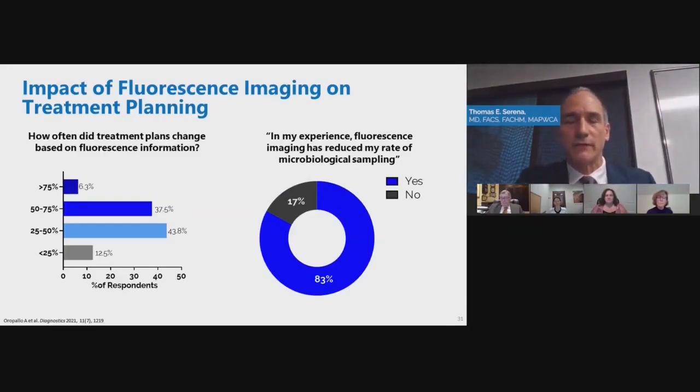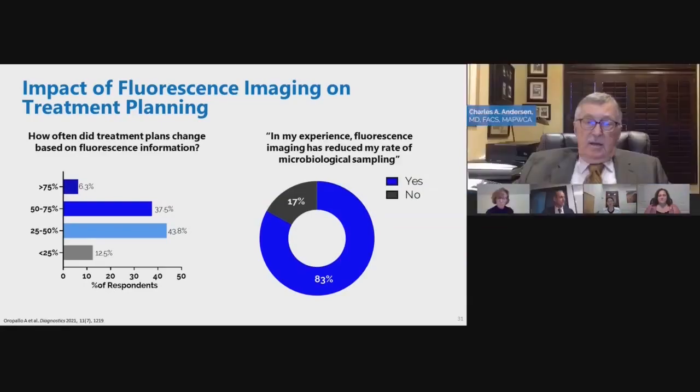It's fairly frequent. I'll just open this up to the panel for their comments on this. When you look at the information that you obtain, not only does it help you decide, as we've talked about, what to do, the type of dressing to use, how often to have that patient come back for reassessment, whether or not you need to add antibiotics, but oftentimes it can help you decide what you're not going to do, including placing of a biologic.